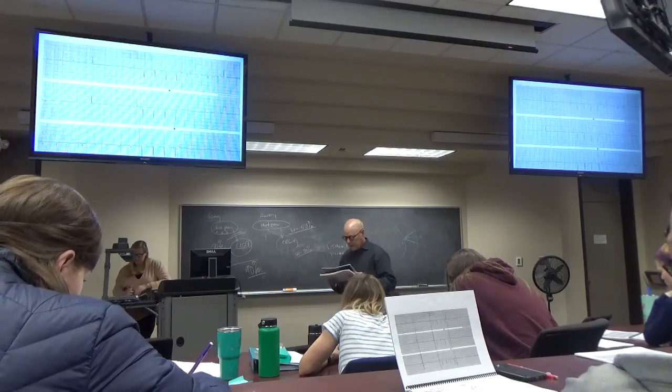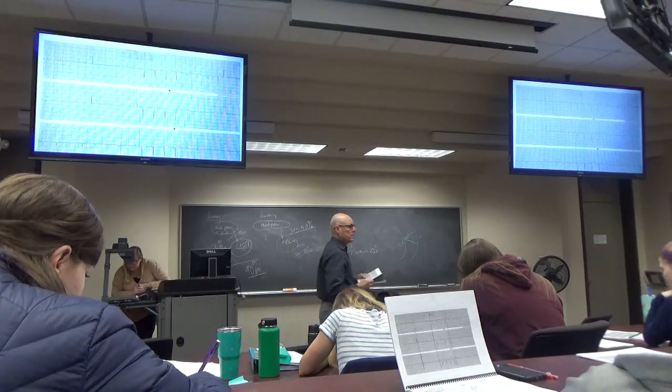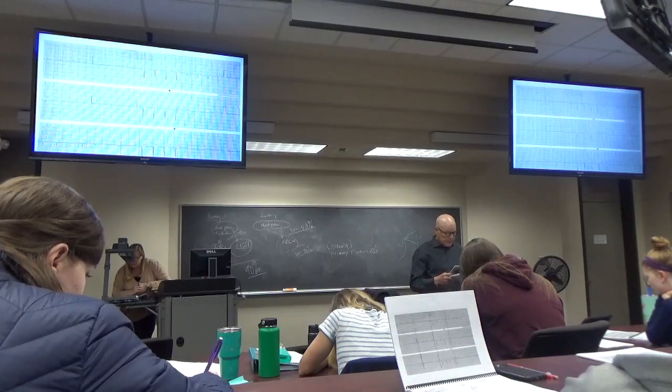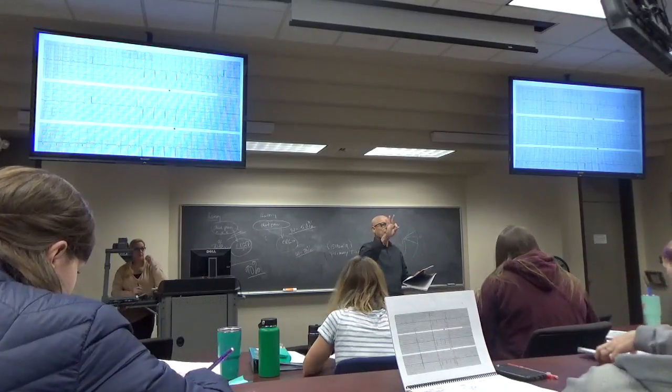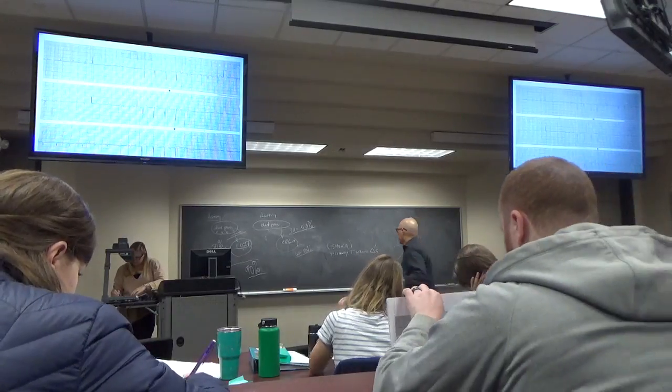How many points on the Estes criteria do you get for a biphasic P wave? That was atrial, though, not visible. It is atrial, but in the Estes criteria, you get some points. Okay. Yeah. How many points? Three. Yeah. You get three if you have, well, here's what Estes says.